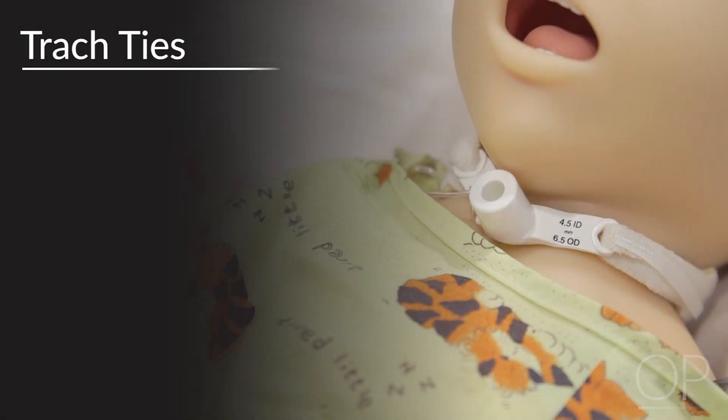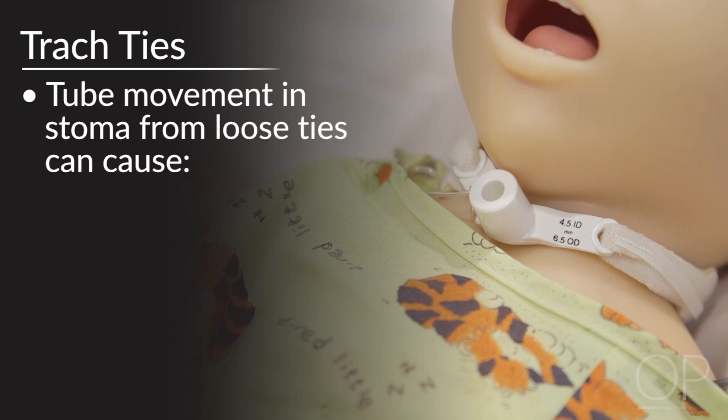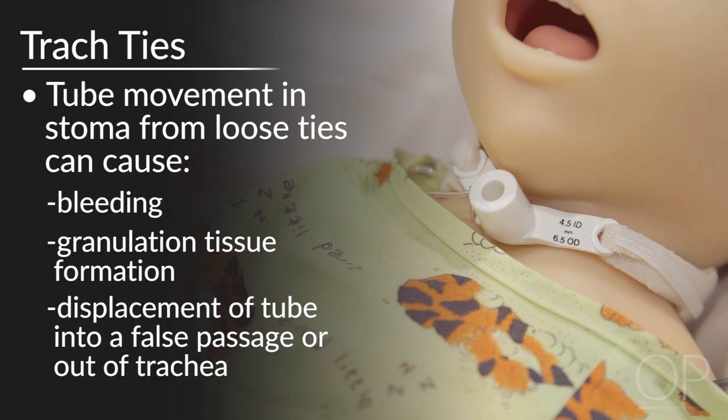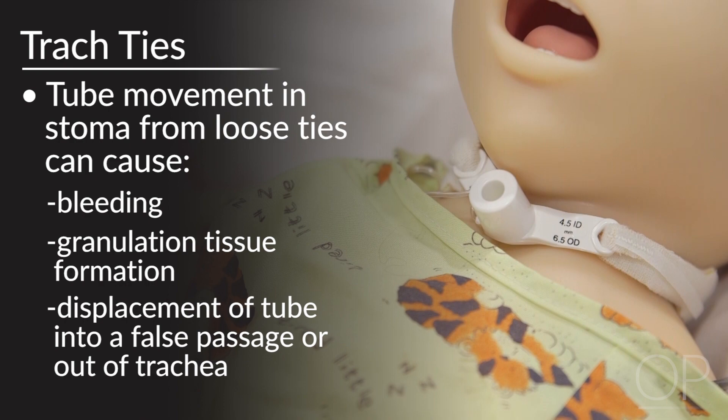Lastly, a tracheostomy tube must be secured snugly, and is typically done so with a soft Velcro tie. Loose ties can lead to movement of the tracheostomy tube within the stoma. This can cause bleeding, granulation tissue formation, or displacement of the tracheostomy tube into a false passage or out of the trachea. These complications are easily avoidable by ensuring a snug fit at all times.